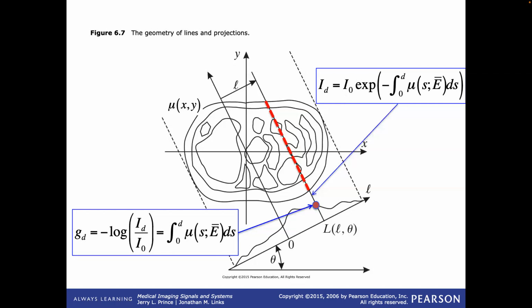Yeah. So how do we know what's going in? Is that like a nominal value, or is it calculated by the machine? That's a really good point. So the question is, for those online who can hear, how do you know this value, I naught? Like how do you know what that intensity is going in?